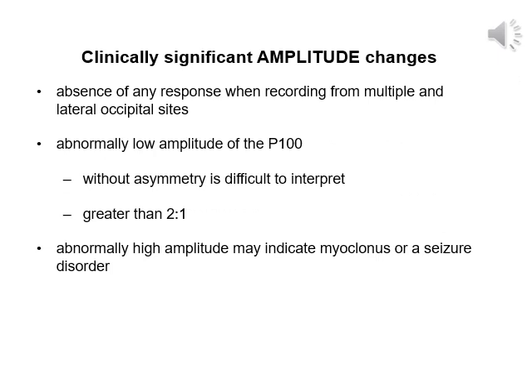Amplitude is not typically a criterion used to call a VEP abnormal, except in the case where the VEP is entirely absent, or in the very rare cases where the VEP is of very, very low amplitude. However, it's very difficult to interpret this without seeing some sort of asymmetry between the eyes. And so if there is an asymmetry between the two eyes, then the eye that shows an amplitude that is 50% less than the other eye is considered abnormal.